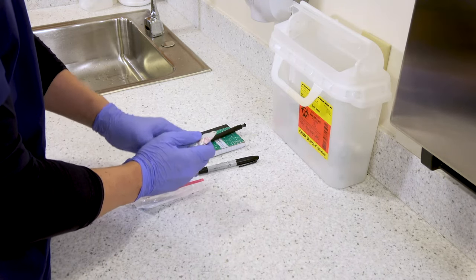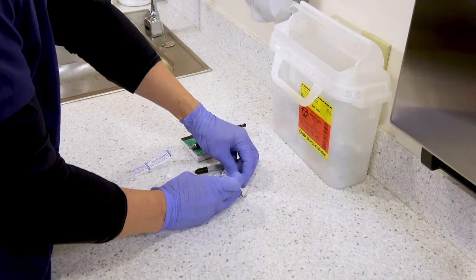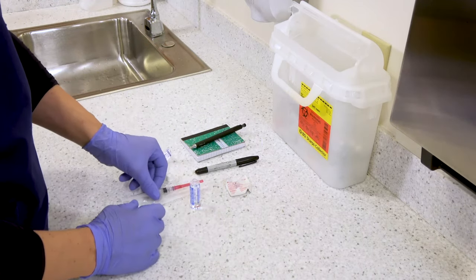Once you have snapped the top of the ampule, you want to carefully take the glass part that has come off and set it aside or directly into the sharps container if you have one available.